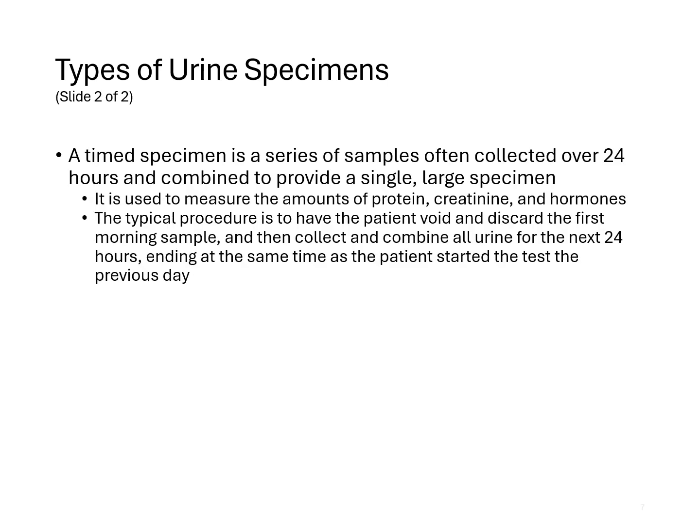There's also a timed specimen. And this is a series of samples that are collected usually over 24 hours, and then it's combined into one single large collection container. That is used to measure the amounts of protein, creatinine, and hormones.